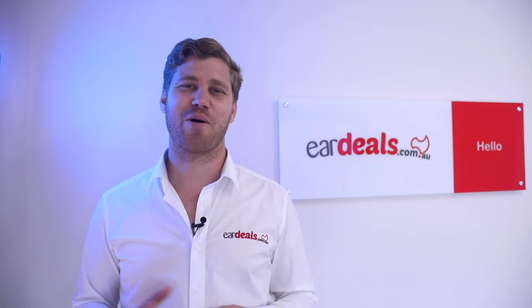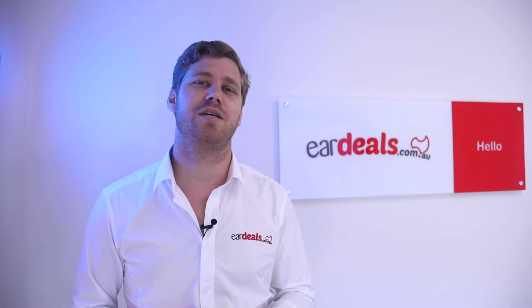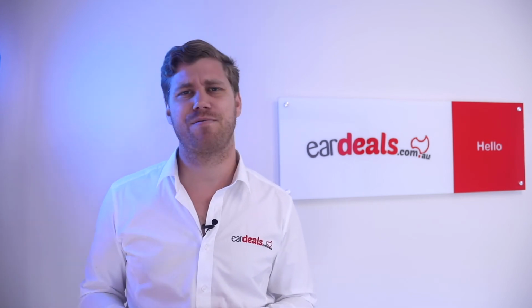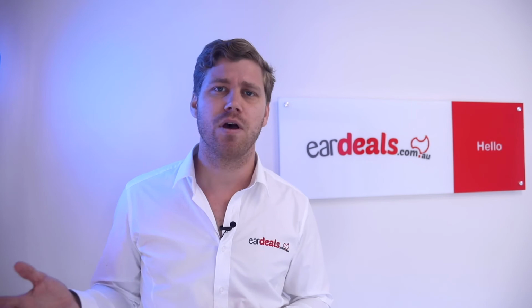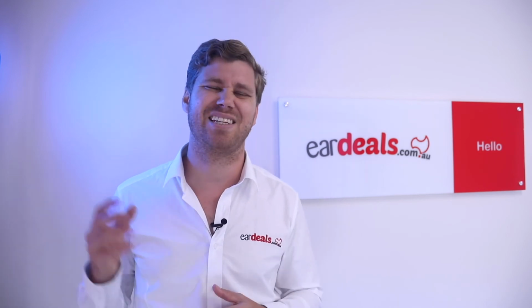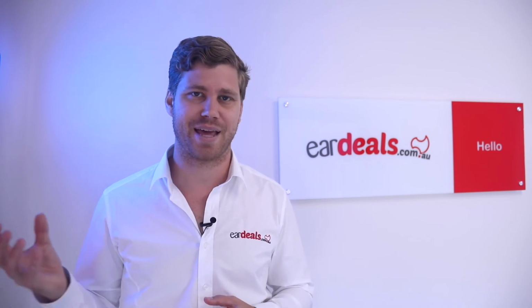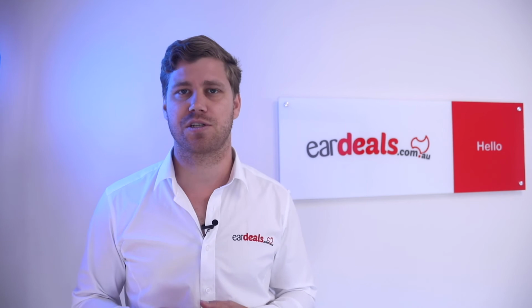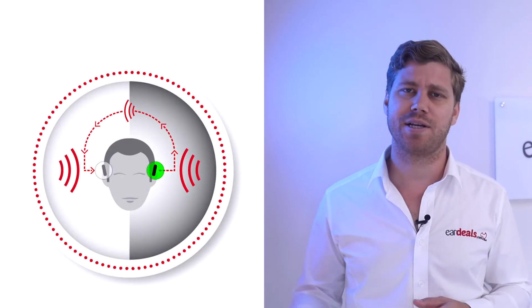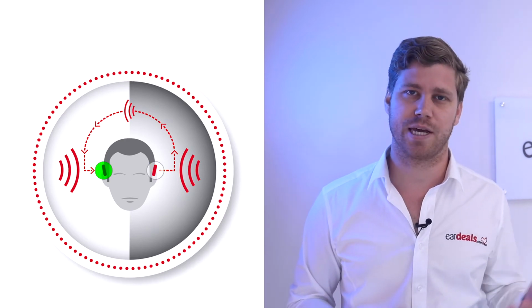The Pure Charge Go X comes in a Cros option. Now, what is Cros? Well, Cros is a device that sits on a bad ear, for instance, an ear that is profoundly deaf or has significant hearing loss, where the person with that bad ear is not really getting any function out of the hearing on that side of their head. The Cros device is designed to sit behind the ear, the same way a hearing aid does, and transmit across to the good ear and the hearing aid on that good ear.